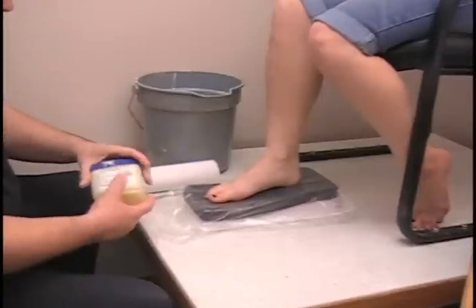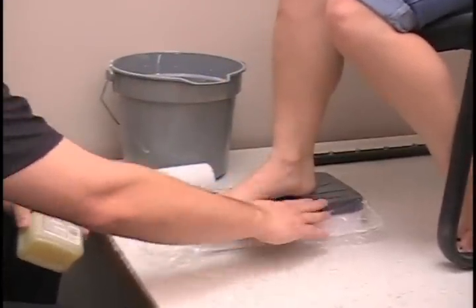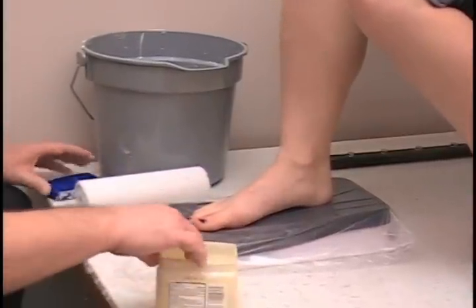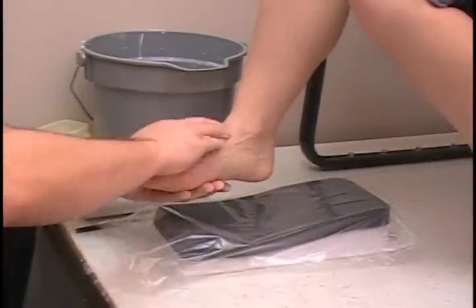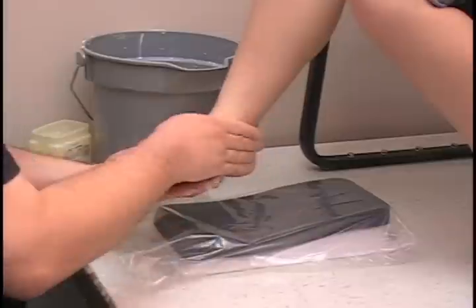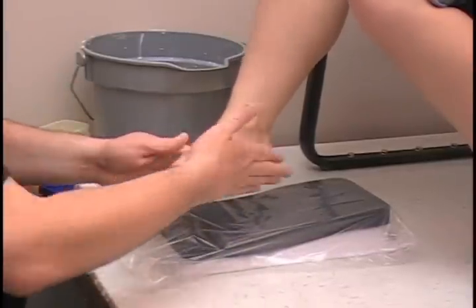We are going to start by making sure the patient is in the right position: 90 degrees at the knee, 90 degrees at the ankle, right on the block where the heel rise starts. Then we are going to put some separant on. Just put it on generously. This will make the cast come off a lot easier and gives a nice even look inside the cast.